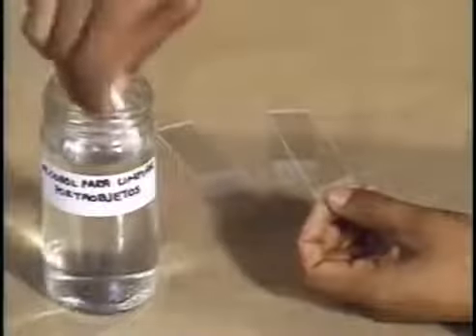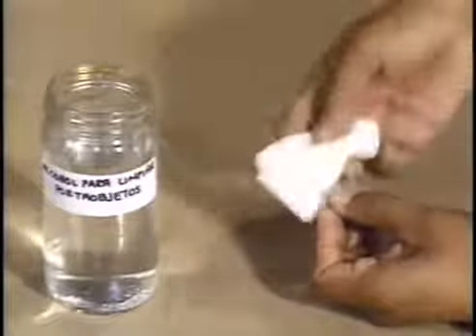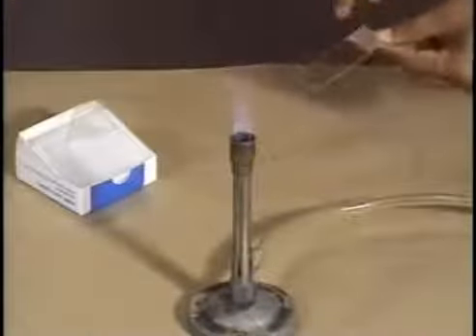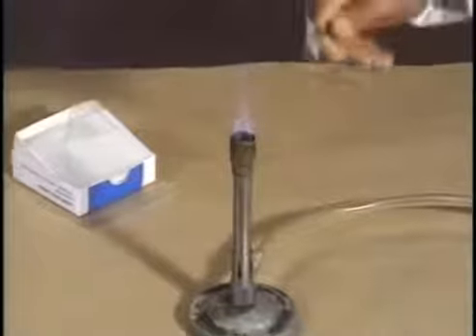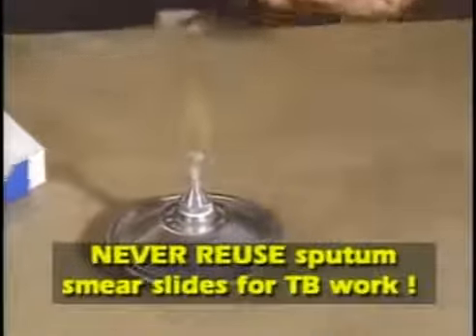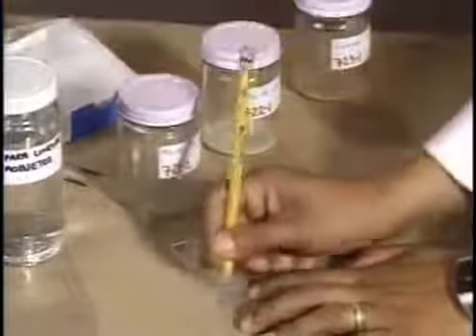Always use new slides when preparing AFB smears. They should be cleaned with alcohol and wiped dry, or passed briskly through a flame. This will remove any residue of oil that could interfere with staining. Never reuse sputum smear slides for TB work.